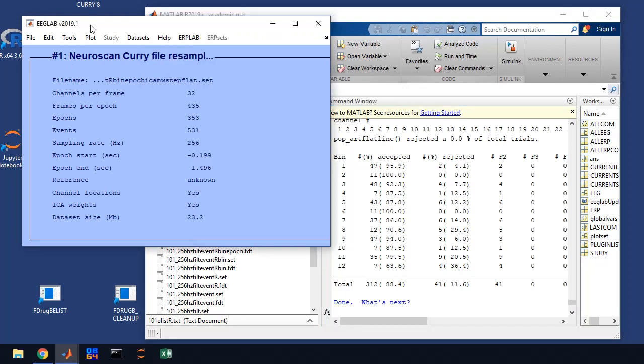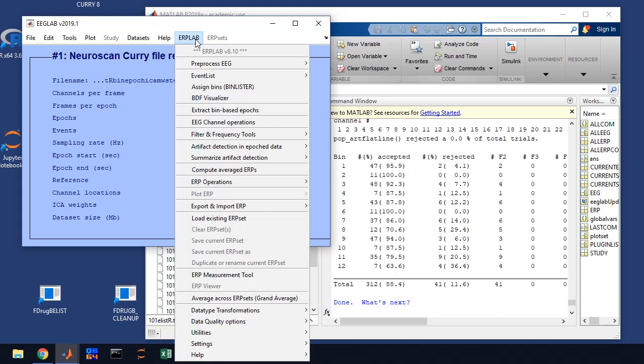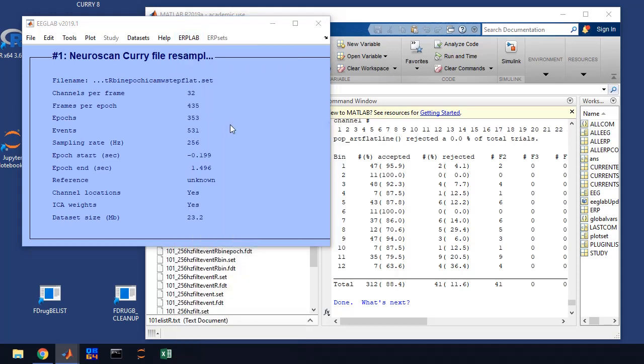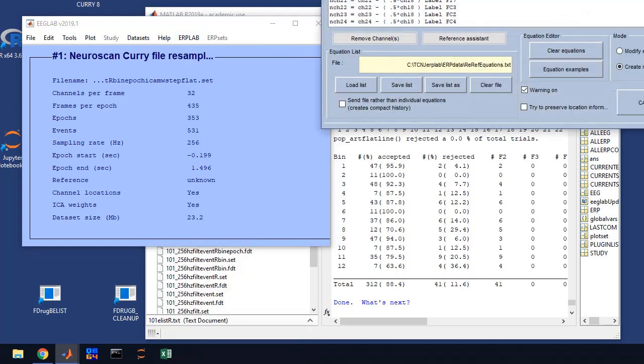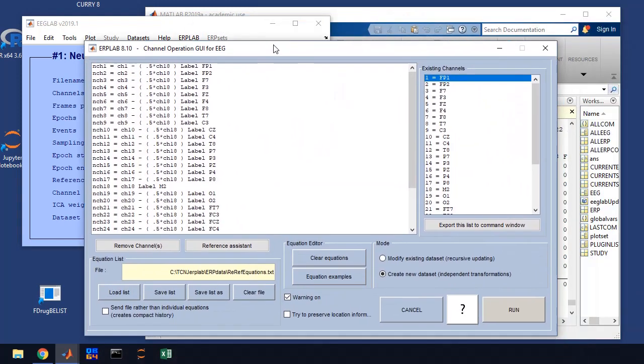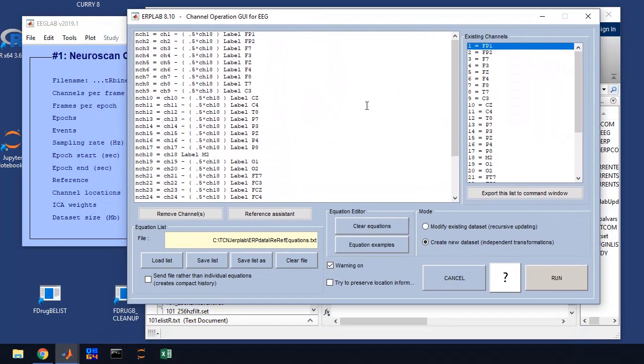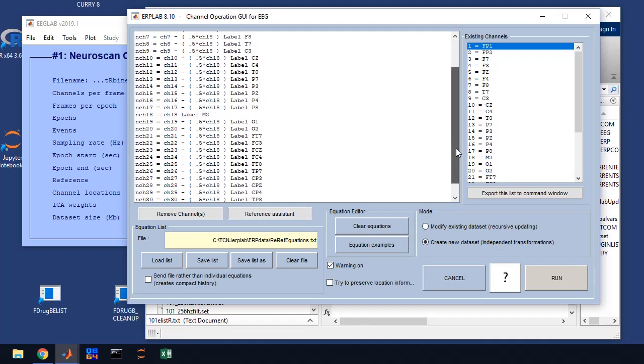So what we're going to do, the next step, is to re-reference the data to the average of the left and right mastoids. You go to EEG channel operations, you're going to get a pop-up window. It should be automatically populated, if it's not, you can load this file that has the equations in it, and basically this will re-reference it to the average of the left and right mastoids.